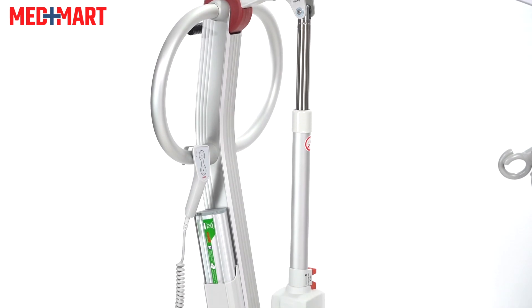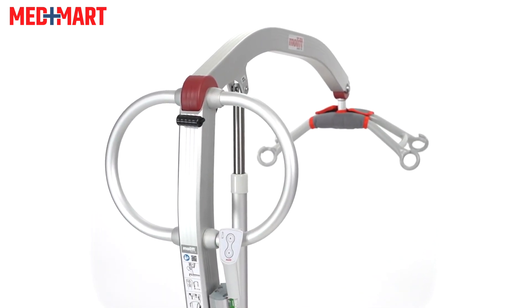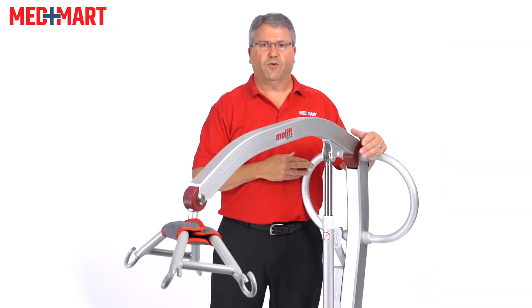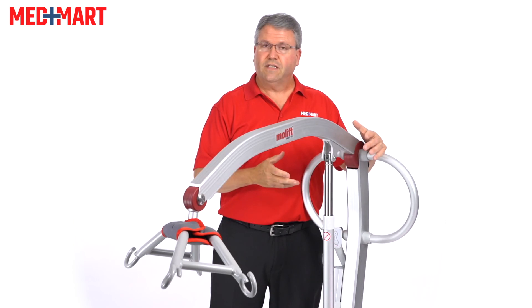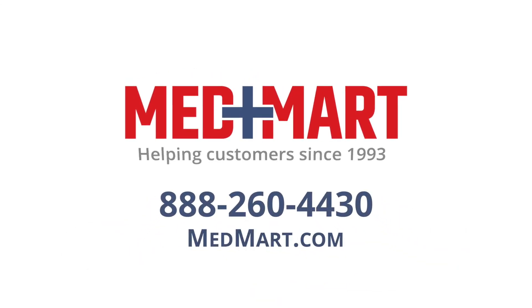The Molift Smart 150 from ETAC is a great lift — under 58 pounds, great material, great build, easy to fold, easy to break apart, and easy to travel with. The Molift is a great choice. For more information on this lift or any other lifts at MedMart, give us a call at 1-888-260-4430 or shop online at MedMart.com.